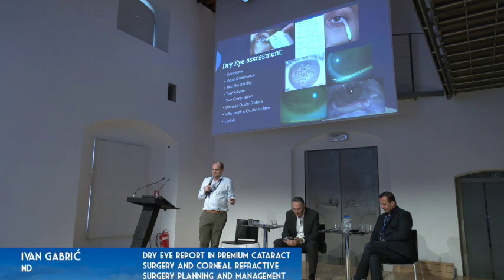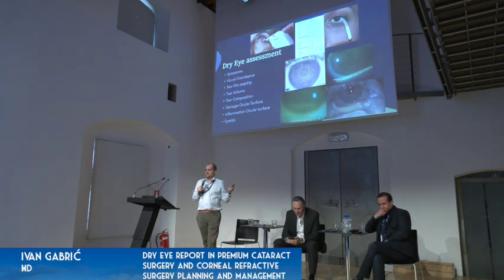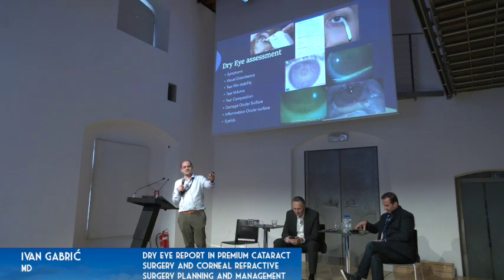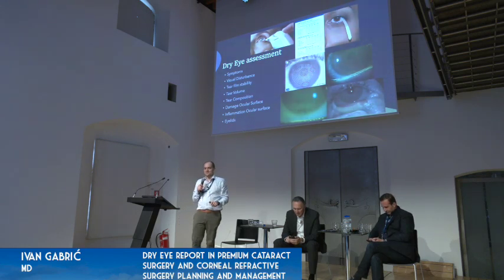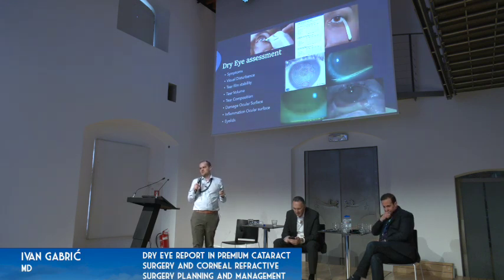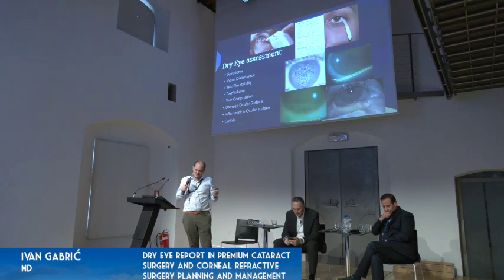I look at the tear film stability. Every person gets a regular non-invasive tear breakup time on the CSO devices. It's available on Antares, on Moody, on MS39, on Sirius, and on Osiris T. So amazing. Then I don't look at the tear osmolarity. It's not easy to do, and it has low predictability in most cases.